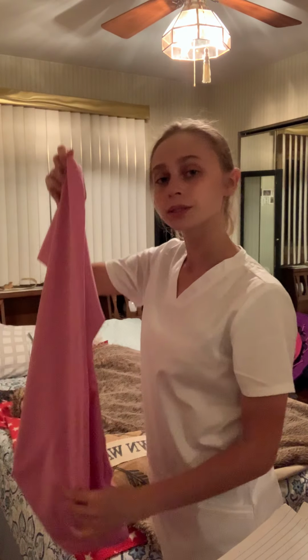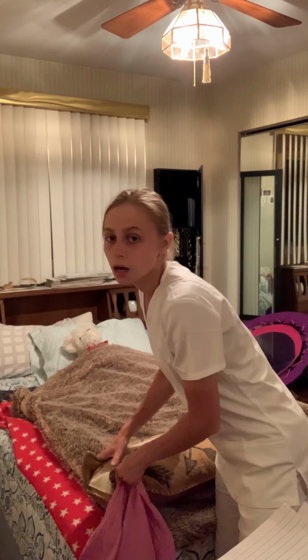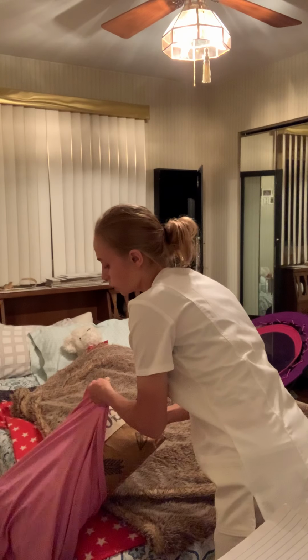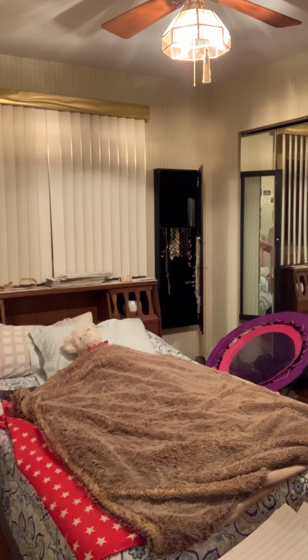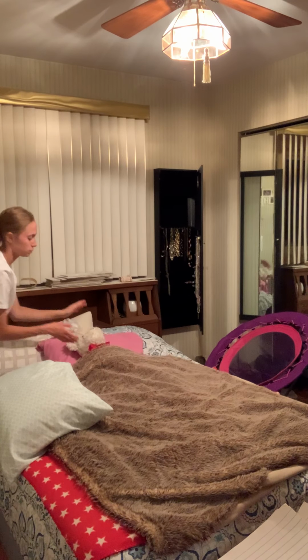So first, this is my clean linen, and then you are going to want to make a V with the pillow, and then with your other hand, tuck it in, and then just work your way, making it, and then switch the pillows out. And then the pillow goes to the laundry.